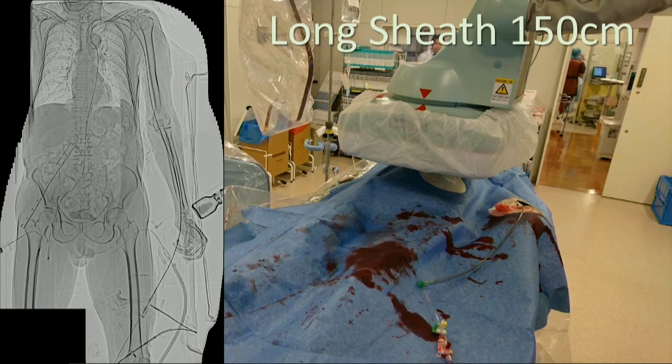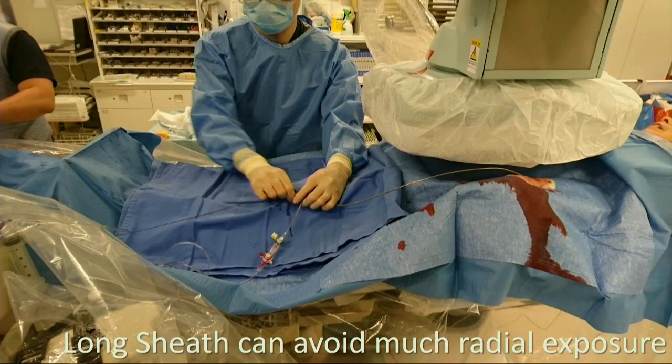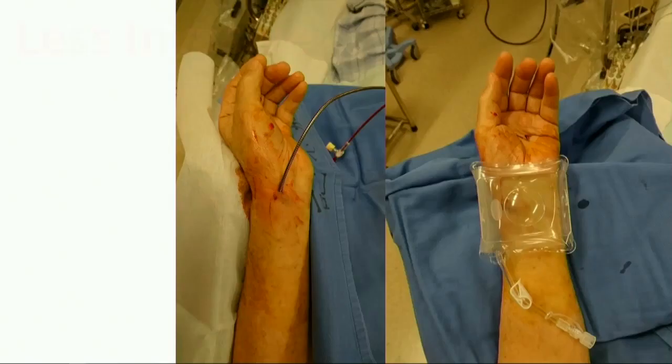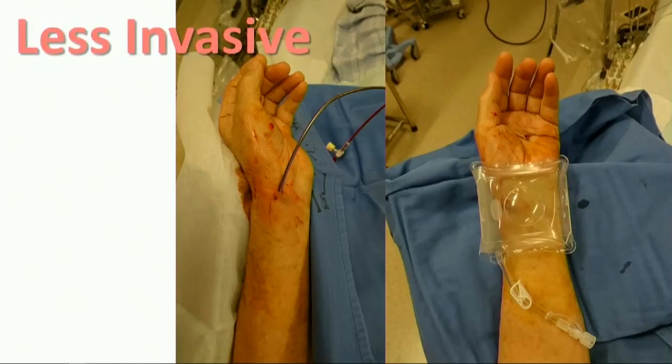As Peter mentioned before, I tried to perform from the radial access like this. I inserted a 150 centimeter destination sheath from the radial access. I think it's very useful and helpful to avoid radiation exposure, so you can insert the sheath from the operator's side. Also, after the procedure, the hemostasis is very, very easy.